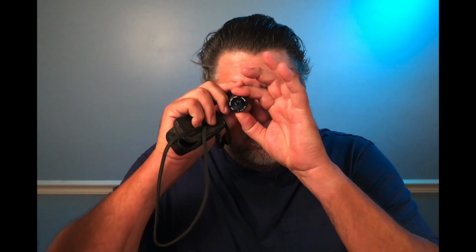You can throw that up there and you turn it from right to left, and you can focus in on something as close as a couple of feet away. I've used this to read the measurements or the readings on a tape measure. I've used this as a device that makes it possible to read road signs or street signs if I'm walking through an inner city or a community.